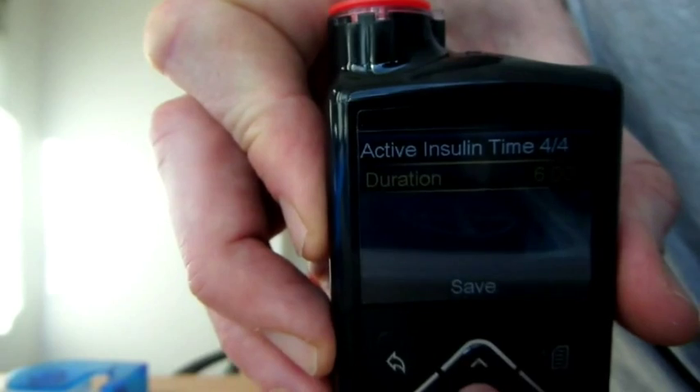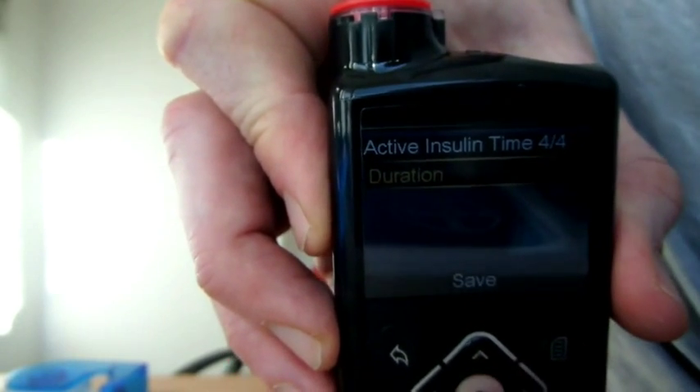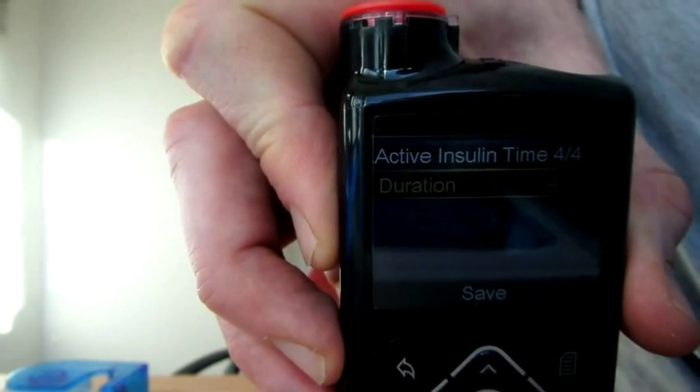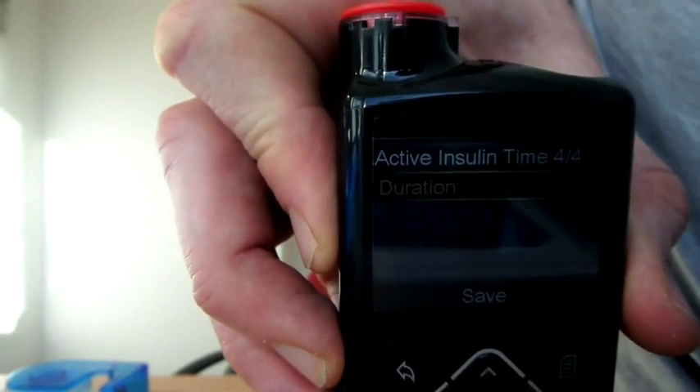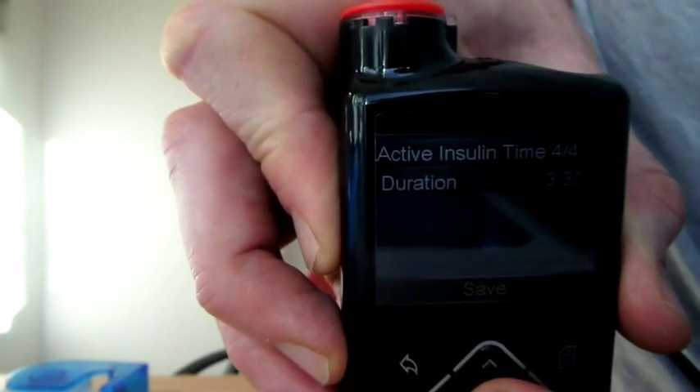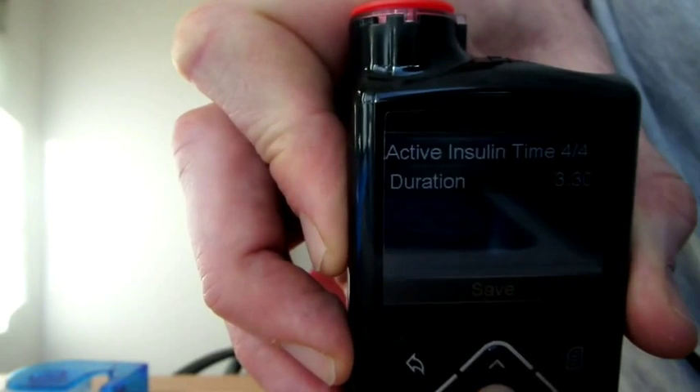Active insulin time — this is pretty cool. Before, I used to only be able to change it in full hours. So I had the dilemma of setting mine at four hours, which is slightly too long, or three hours, which is too short and causing me to have hypos. Now I can go nicely in the middle at three and a half hours. Perfect.